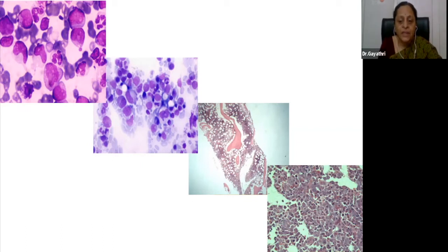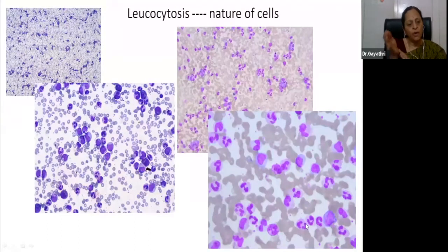But these blasts, if you have not looked at the cytology, you can mistake megaloblasts for these blasts. So you should be very careful. When you report on trephined sections, get familiar with looking at the marrow cytology. Very, very important.